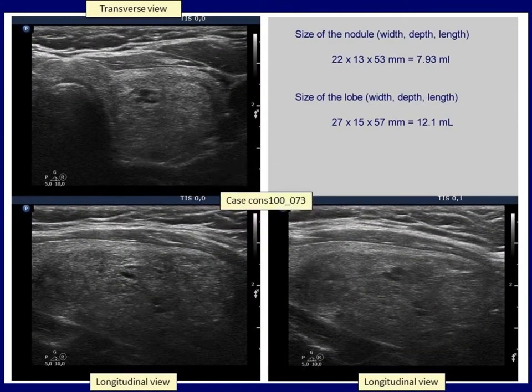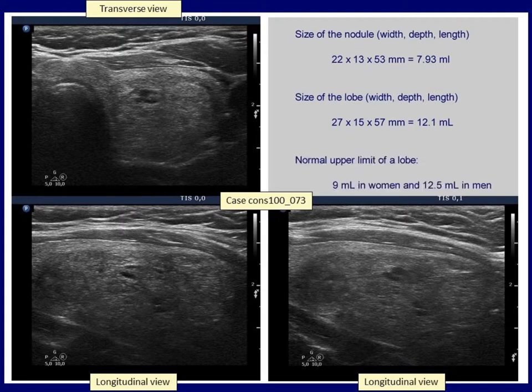This patient had a large nodule — the length exceeded 5 cm. Normally, such nodules require surgery. However, in this patient, the relatively large nodule caused only a minimal degree of enlargement. When the volume of the lobe of 12 mL is compared to the normal upper limit, we see that the value is slightly higher for a woman and normal for a man.